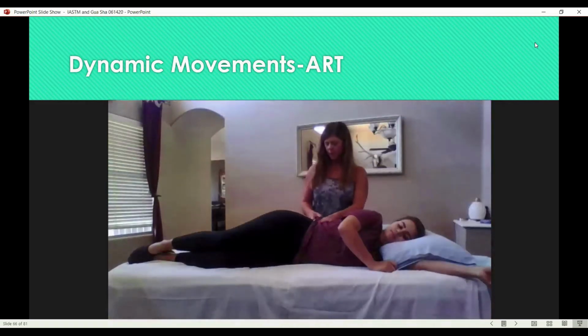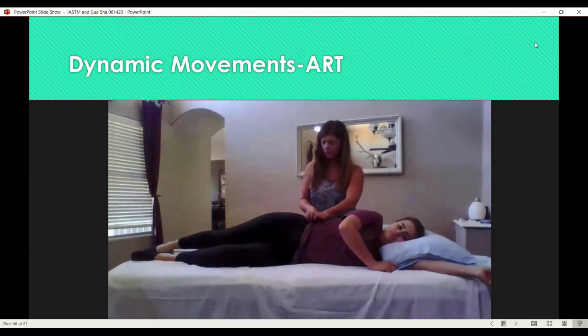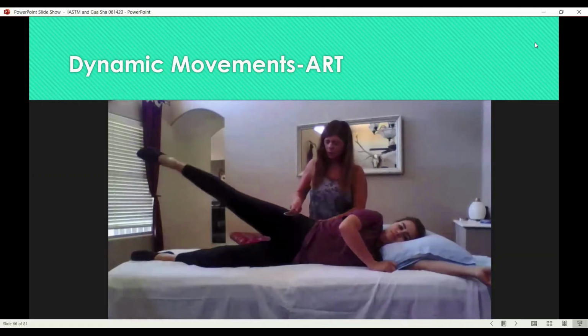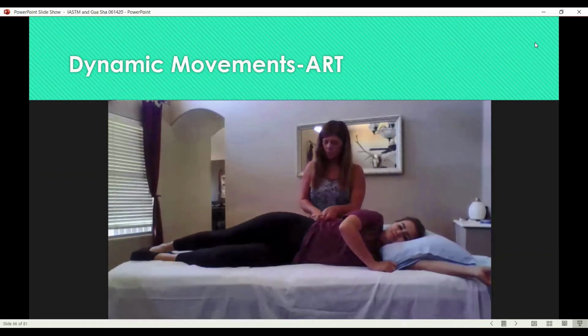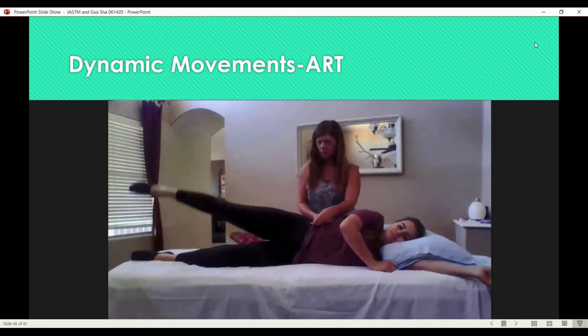Here I'm showing working on the hip, the gluteus medius and minimus. Can hit some trigger points with smaller tools. I can do some sweeping and some brushing and strumming. I can do some framing from the greater trochanter. And here I'm adding a little of that active release, some dynamic motion. So I can do it away from the greater trochanter up towards the ilium, or I can wait and follow her down.